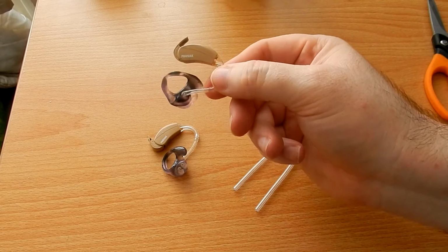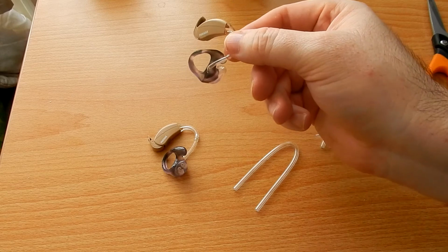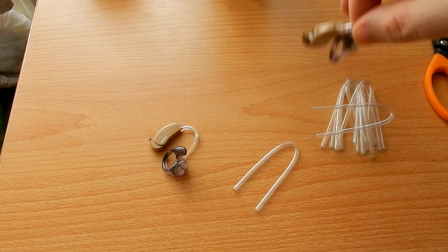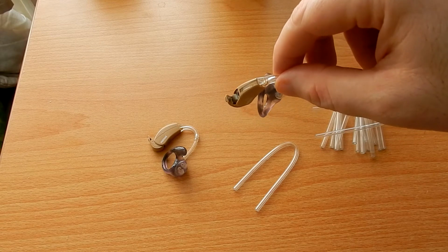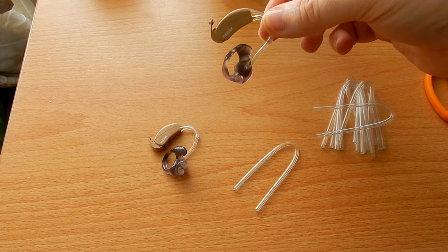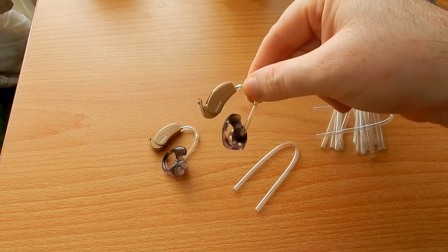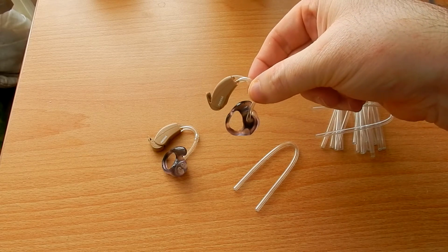Ideally you should replace the tubing every 6 months. Normally you go into an outpatient appointment or something, and the audiologist will do the tubing for you. They do let you, if you know how to do it, do the tubing by yourself. In this video I'm going to show you how to change the tubes so that you can do it at home if you so wish.